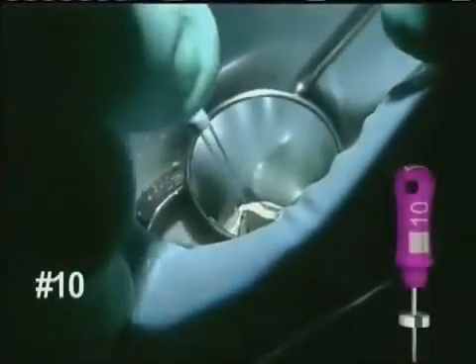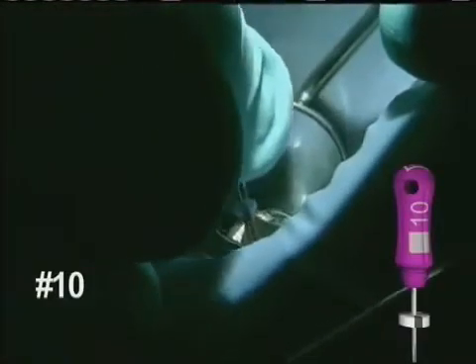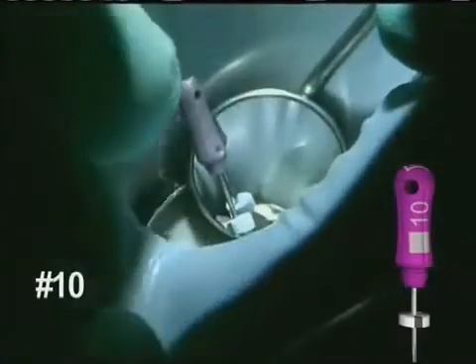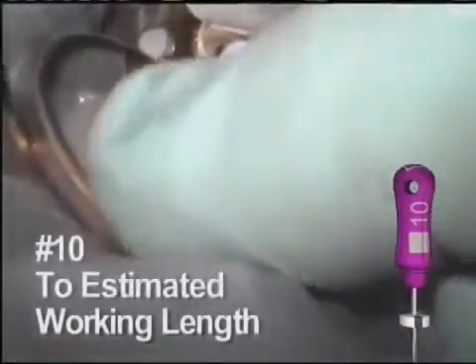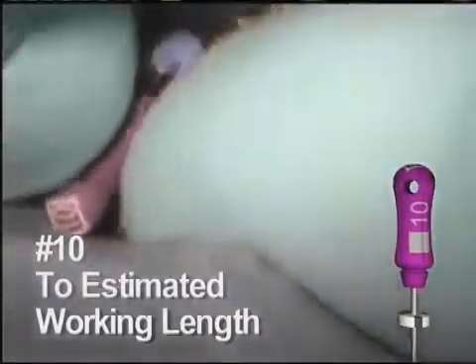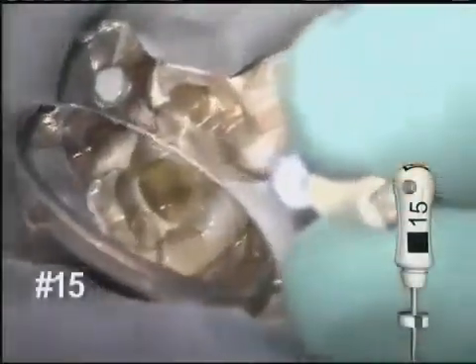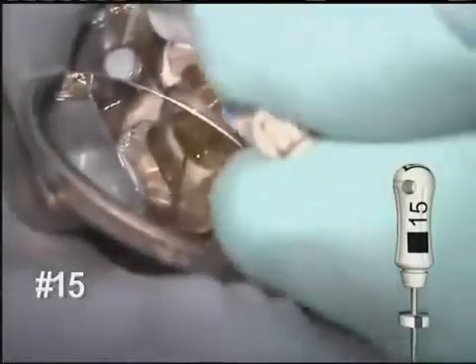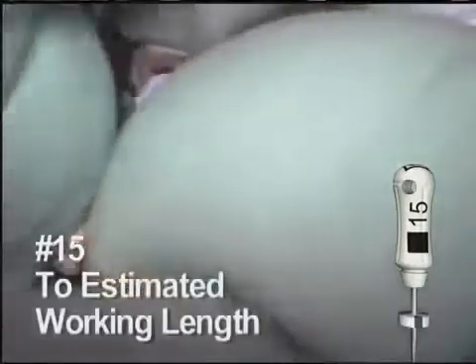After the initial coronal shaping, the number 10 hand file is reintroduced. The 10 is negotiated to the estimated working length and gets to length quite easily here. Because of the coronal shaping done with the earlier instruments, this hand file will normally engage in only the last few millimeters of the space. The number 15 hand file is then allowed to follow.